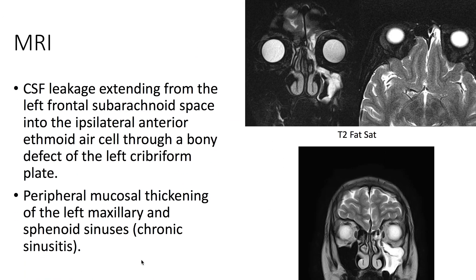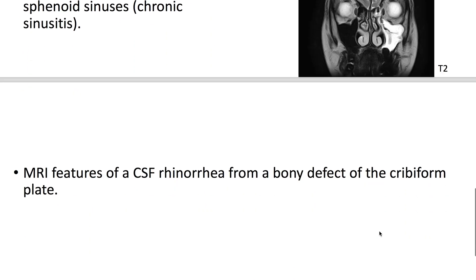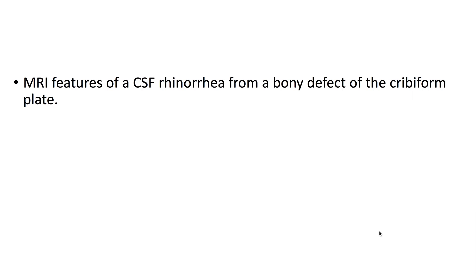On MRI, we see CSF leakage extending from the left frontal subarachnoid space into the ipsilateral ethmoid sinus and then into the maxillary sinus. This occurs through a small bony defect in the left cribriform plate. The MRI features of CSF rhinorrhea from a bony defect of the cribriform plate are demonstrated in this particular case.